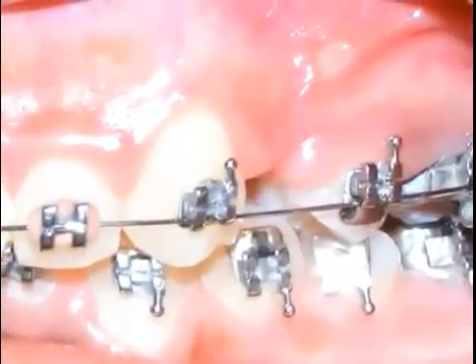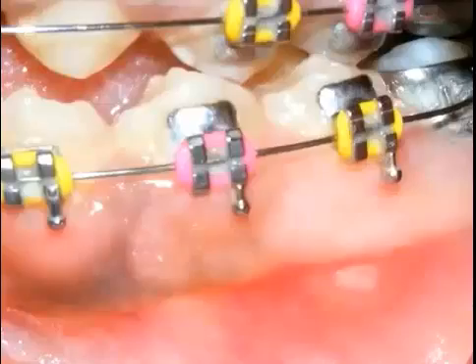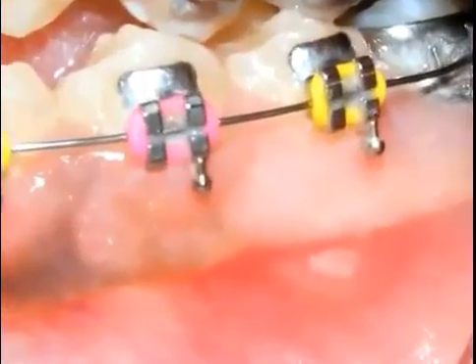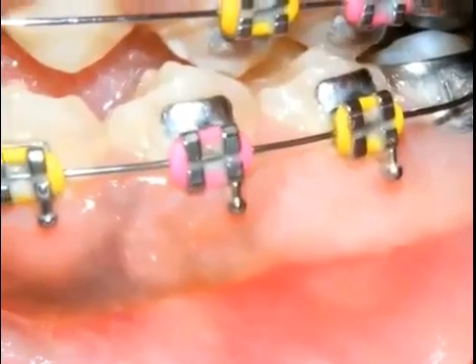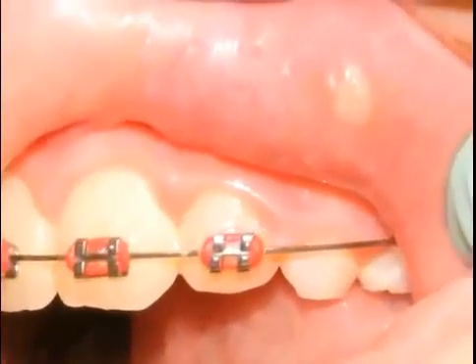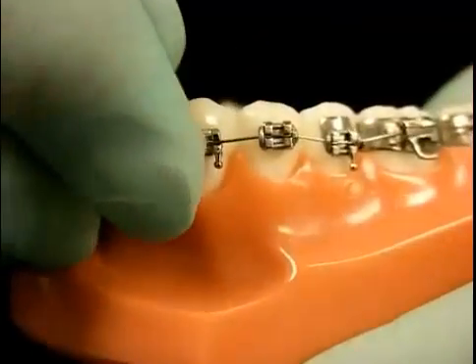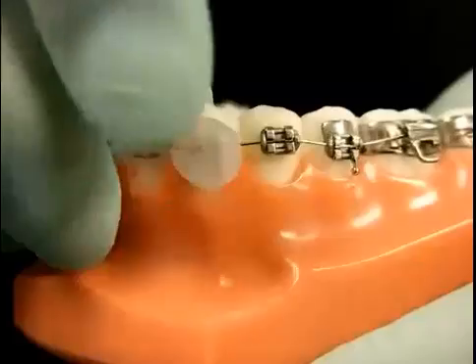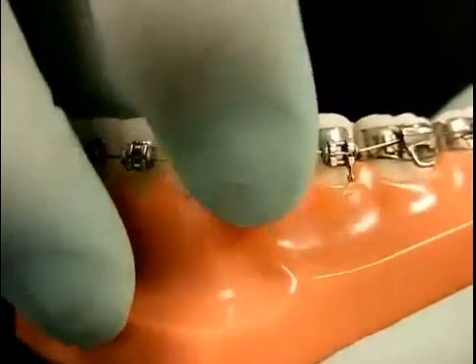During the first week of treatment, you may notice sores or ulcerations inside your mouth. This can happen because your lips and cheeks are not used to rubbing against your braces. Over time, your skin on the inside of your mouth will get tougher and you will no longer have sores. To provide some relief for your lips and cheeks rubbing against your rough braces, you can place a small pea-sized amount of wax or cotton on the area of the braces that is causing the sore or ulceration.